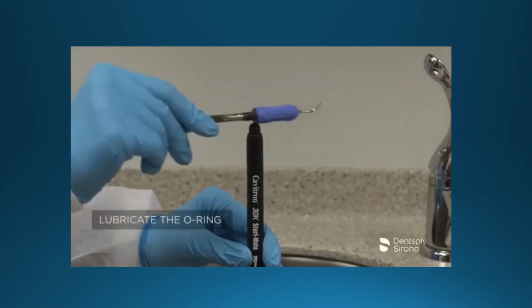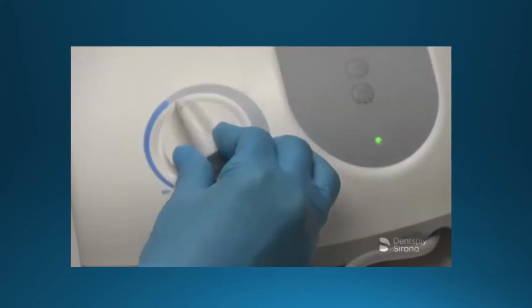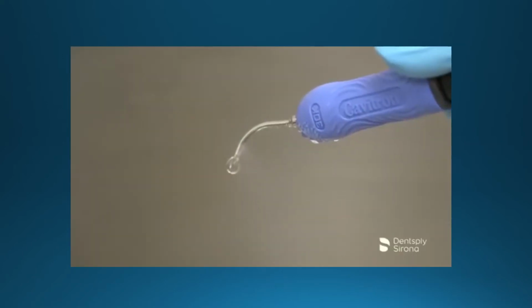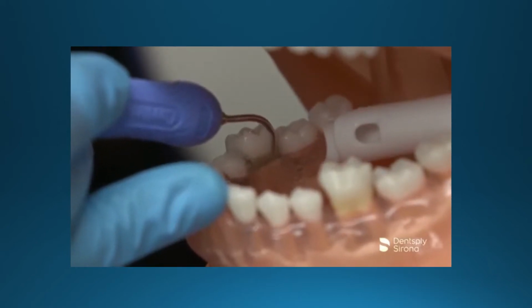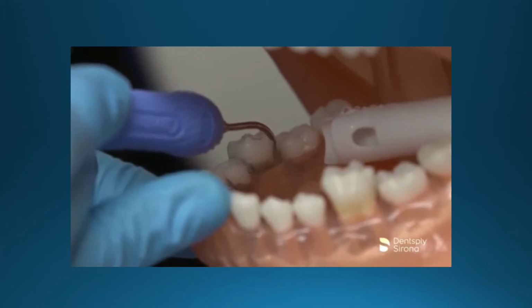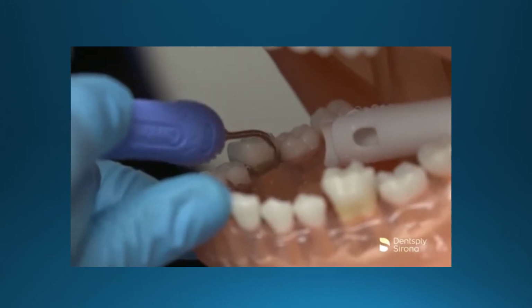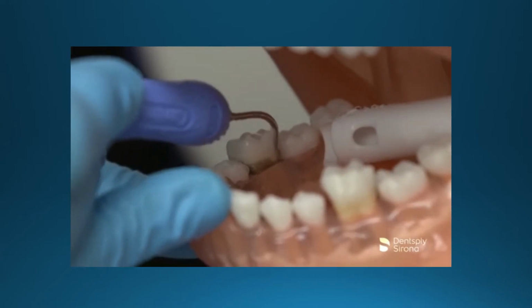After the clinician has filled the handpiece with water, seated the insert, selected the power, and adjusted the spray properly, instrumentation begins according to the treatment plan prescribed for the patient. The double bend shank of the Cavitron FSI 100 allows the clinician to easily adapt this insert in the posterior region. This feature provides access into deeper pockets of the interproximal spaces where heavier deposits may be encountered.